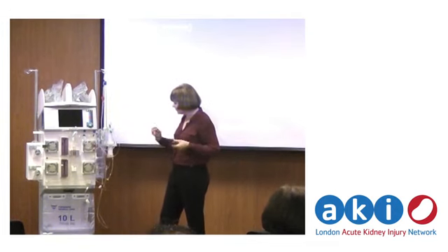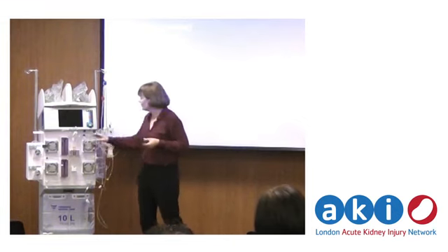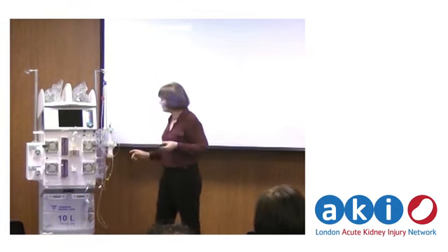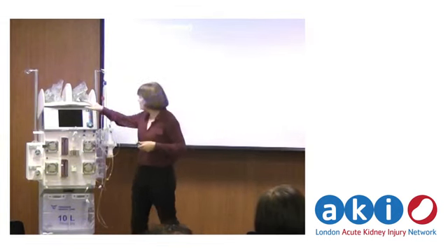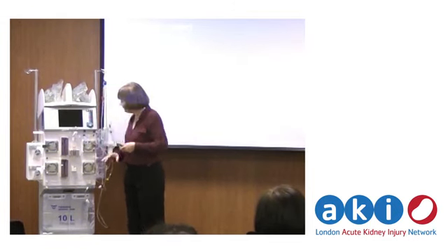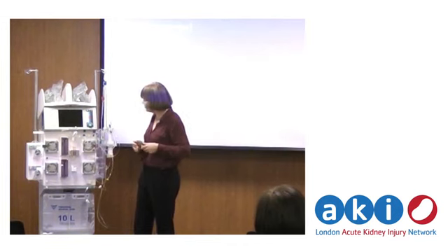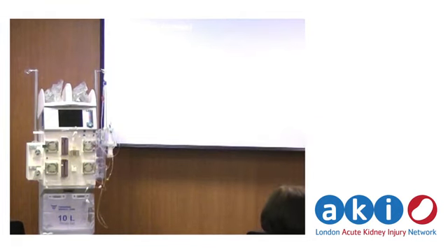So they're very sensitive, we detect the smallest amount of blood leak. What else? Pressure monitoring. I'll talk about pressures a bit more, but that's a very important part of running these machines. The scales, these are here the scales for the clean fluid and the waste fluid, but the arrangements differ according to the machines.